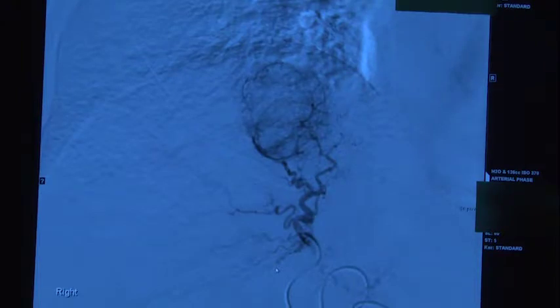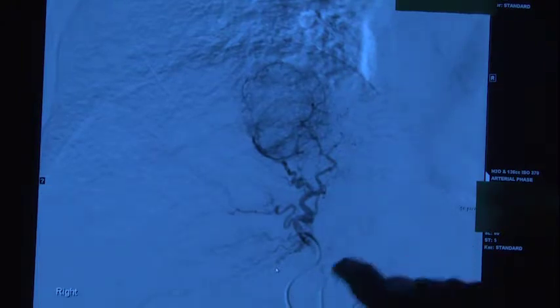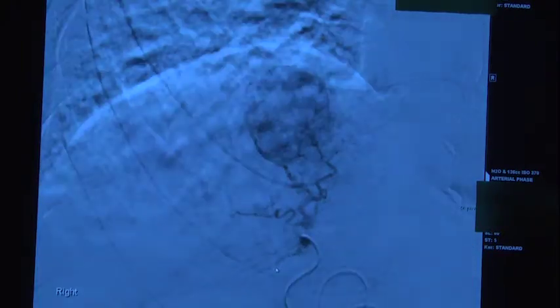So now we have a very small catheter into small blood vessels, injecting that, and at this point we see that we have the primary blood supply to this tumor. So once there, we then can distribute the chemoembolic agent, which was a combination of a chemotherapy and material designed to plug up the vessels.